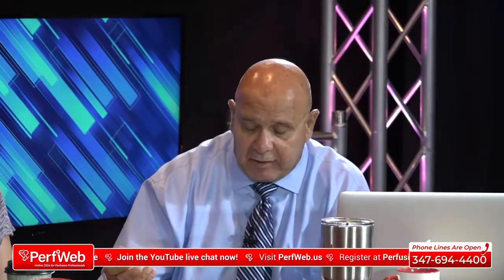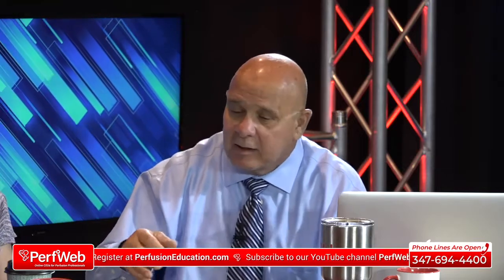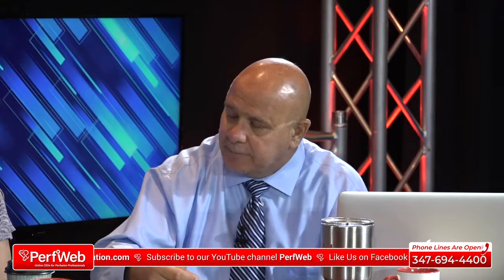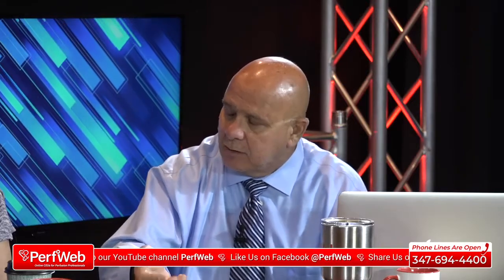Yes. Okay, so the LIDCO, I have a lot of experience with LIDCO too. I was an early adopter of it, and I really liked the device because you give the patient an injection of lithium, so at least you knew that you were doing something good for them. At the same time that you injected, you had the radial catheter connected to a pump pumping blood out at a specific rate.